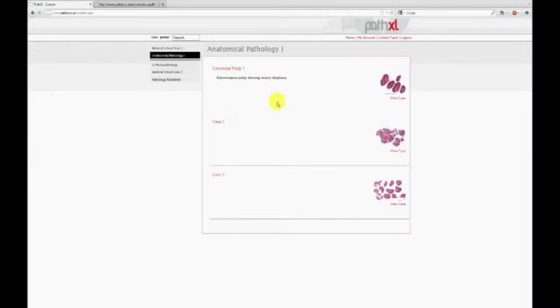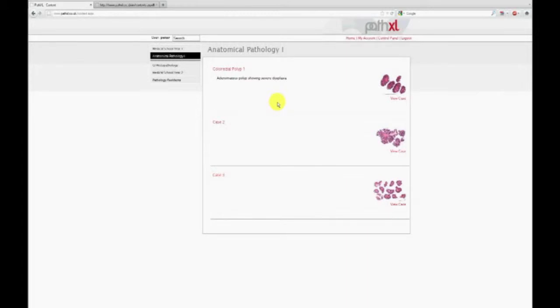This simple example shows how easy and fast it is to create content and present it in an attractive, modular, nested fashion for a range of course types. The structure, layout, organization, content and presentation is determined by you and the type of course or training program you want to develop.